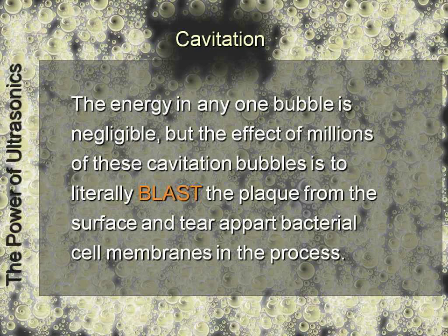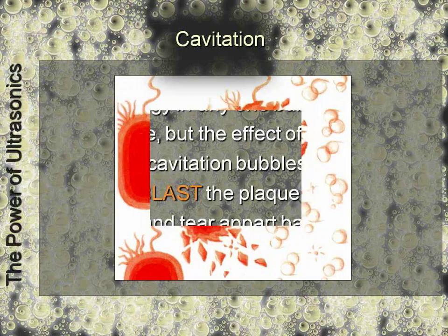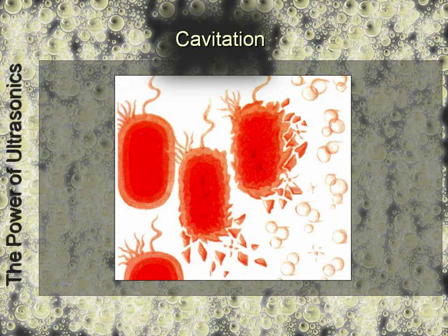Some companies say that if you have an ultrasonic unit, you also get an antimicrobial effect. And this is based on what you'd get in the laboratory. If you have a mixture of bacteria, you're interested in the DNA, you sonicate this mixture, and then the cells will break and you can extract the DNA. So people have thought that if you move the tip subgingivally, you might also have an antimicrobial effect. And with this expression go these pictures. These are the cavitation bubbles, and these are the bacteria that explode.